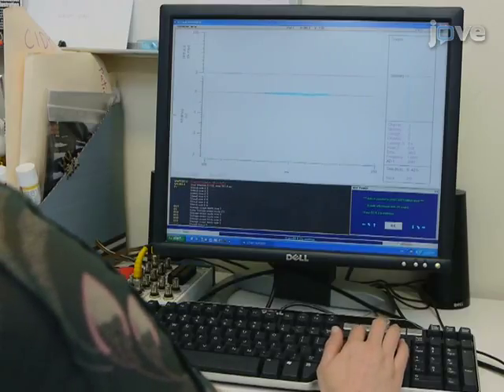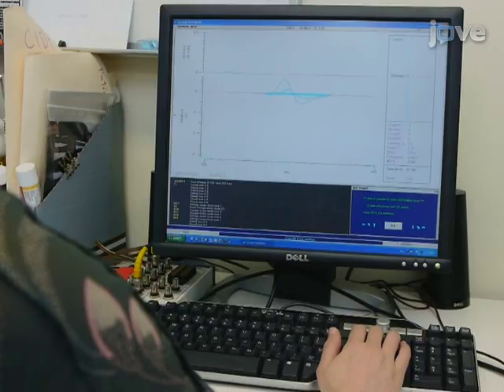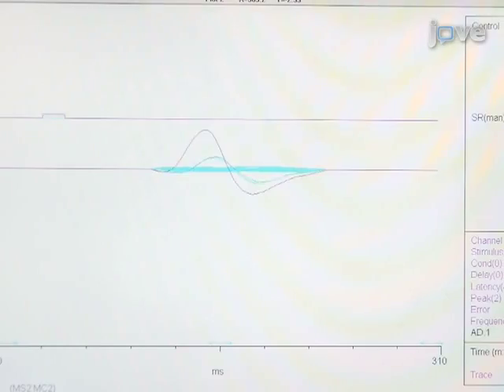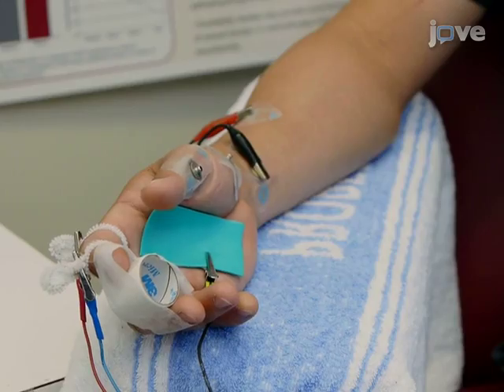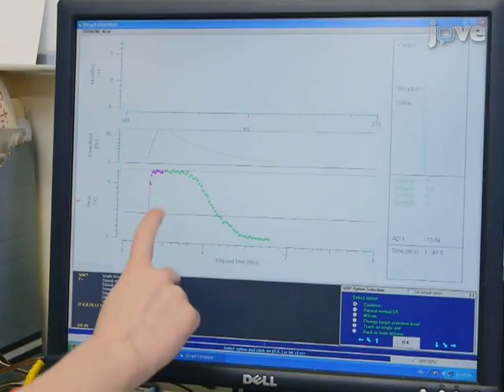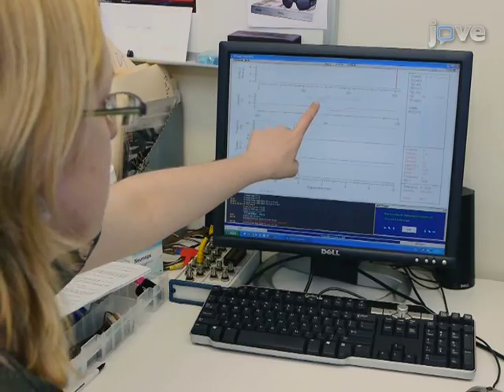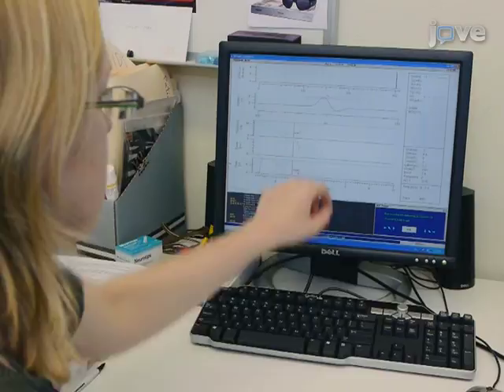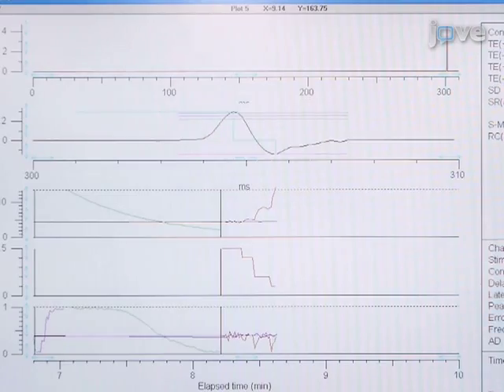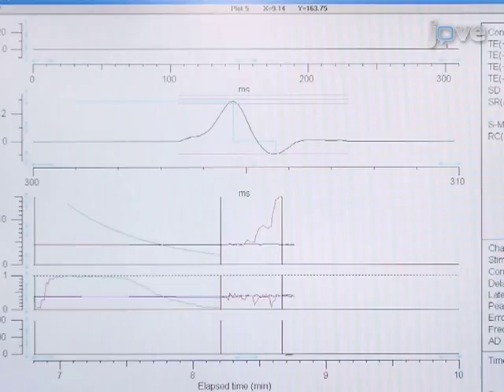To begin the excitability protocol, record a stimulus-response curve by incrementally increasing the stimulus until the response is maximal and does not augment when stimulus intensity is further increased. The target amplitude for threshold tracking should set automatically to 40% of maximal amplitude, corresponding to the area of steepest slope on the stimulus-response curve. Changes in threshold current required to achieve the target amplitude should be tracked online. Record multiple excitability parameters including threshold electrotonous, recovery cycle, and current threshold relationship.